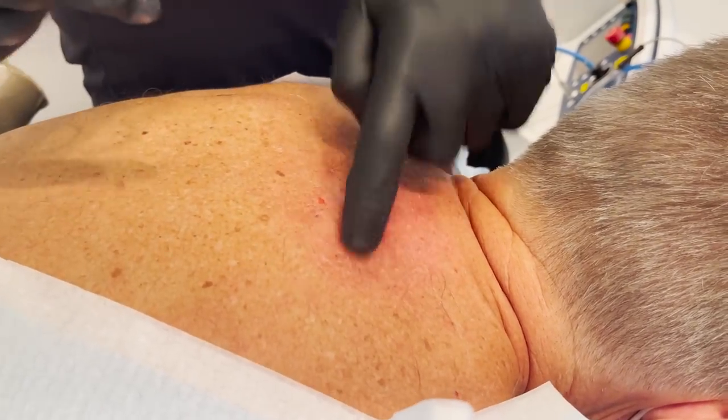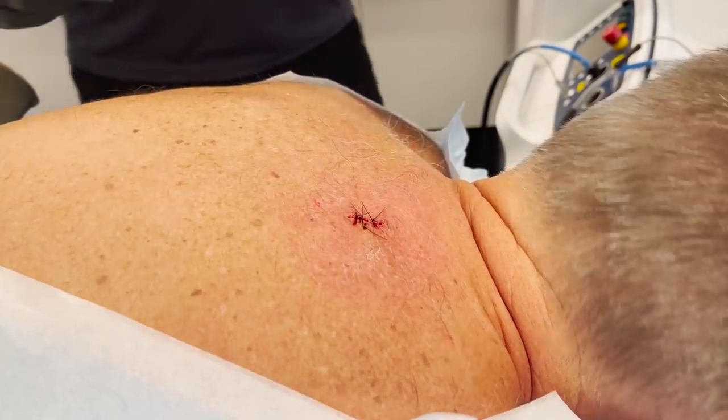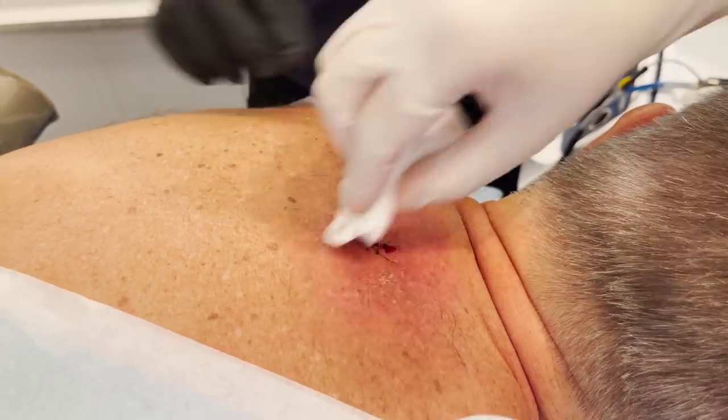That's it. Just going to make sure everything looks okay before I put a dressing on you, and you're done. Any questions at all? Okay, my pleasure. I'll see you in a couple of weeks to get those stitches out.